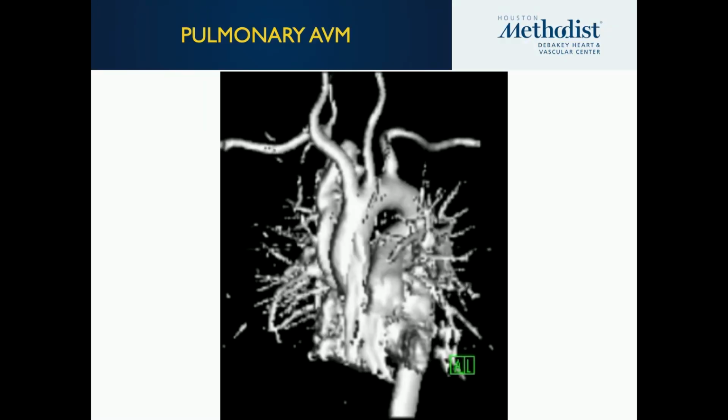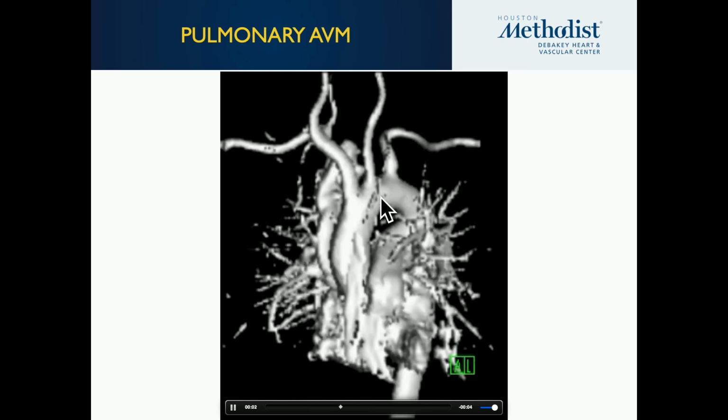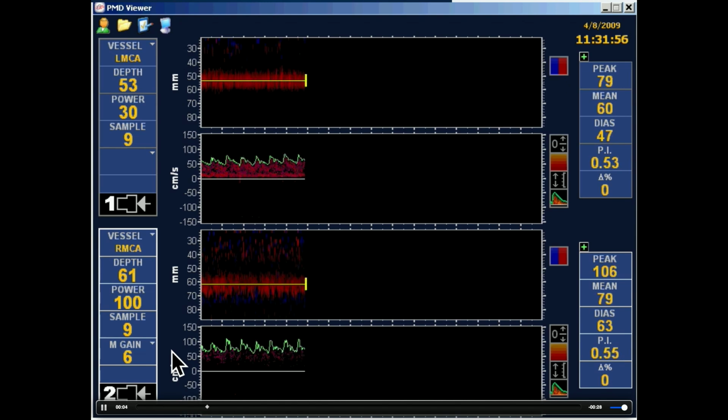One of the pitfalls we have to admit is your pulmonary AVMs. So here's a big AVM, it just showers for 2 minutes, and we think this is right to left shunt. No. And this is my other pitfall that I wanted to teach you today.